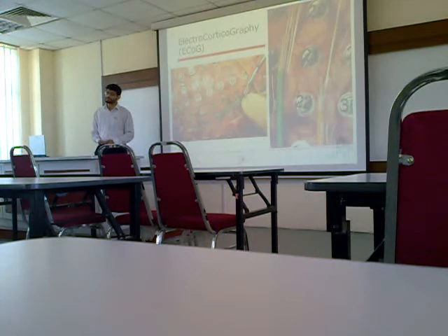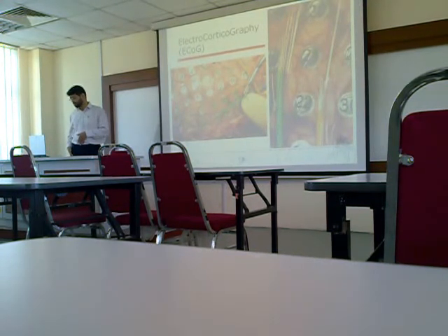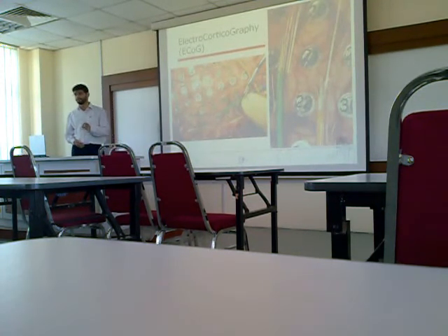Maybe the better type is electrocorticography. It is an EEG machine, but the electrodes are put directly on the brain itself. It is a highly invasive technique, but it is still used in clinical hospitals because some patients need surgery. It is most commonly used for epilepsy, where patients need some surgical intervention to remove some parts, so they need an accurate method to visualize where the most affected part is so that they can remove it.